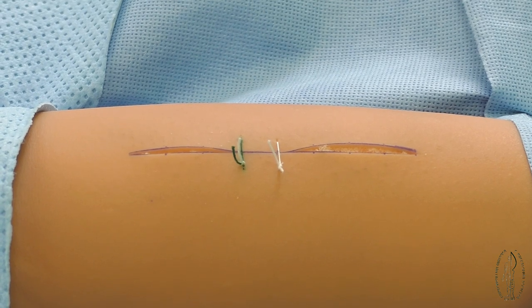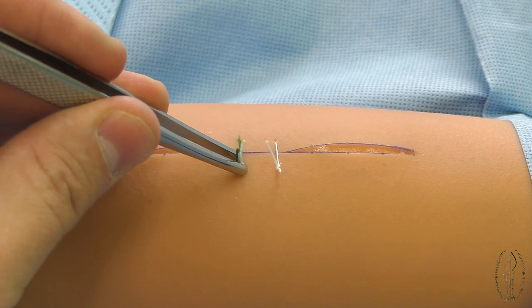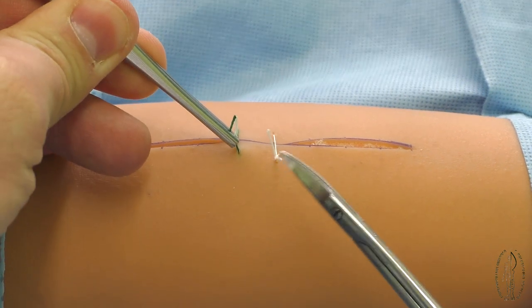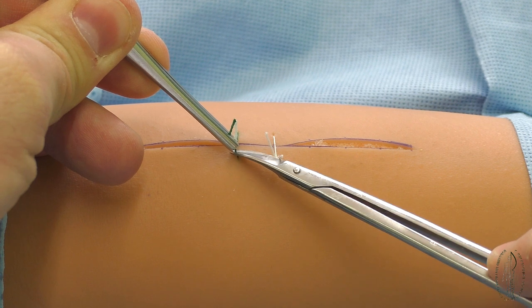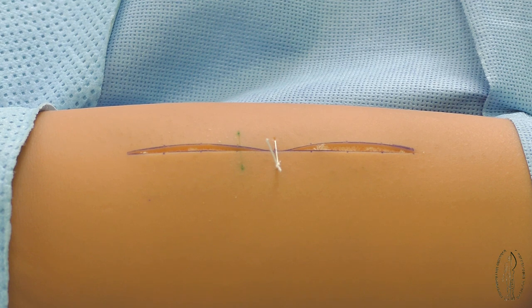The skin suture removal is carried out with the application of surgical tweezers and scissors with a peaked branch. The suture knot is fixed and tightened up by the tweezers before the occurrence of a filament from under the skin. The peaked branch of scissors is brought under the small knot, the filament is crossed, and as a result the suture leaves.